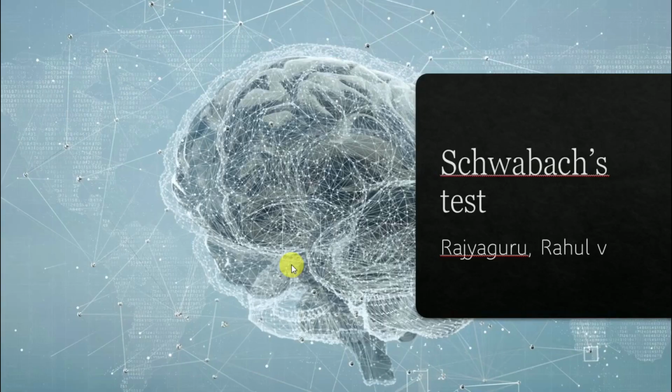Hello everyone, I am Rajyaguru Rahul. In this video, I will describe Schwabach's test. It is a tuning fork test, so before the description, I will demonstrate how it is done. Sir, yes please, have a seat. Thank you. Okay, hello, so I am Dr. Rahul Rajyaguru. And what brings you here today?